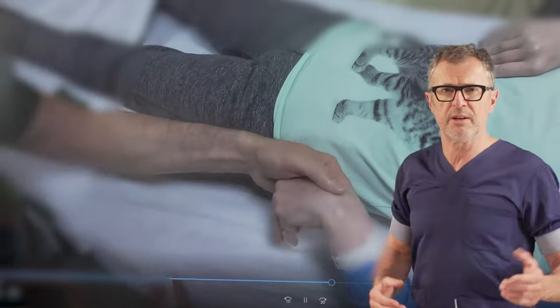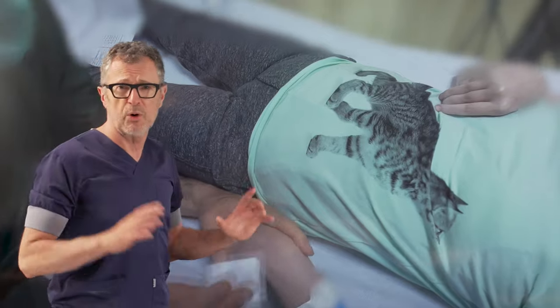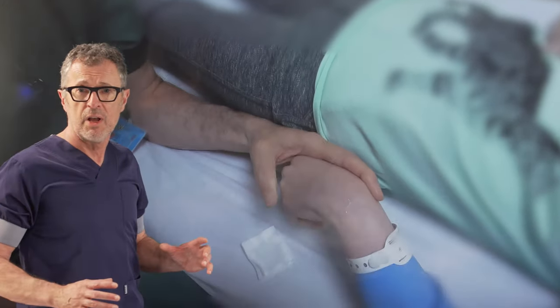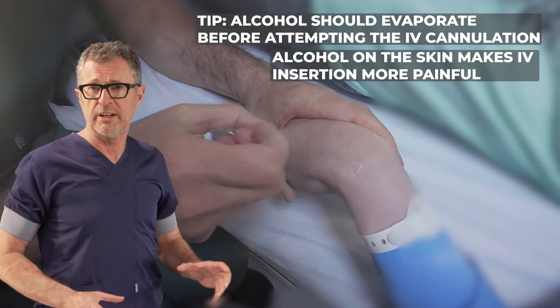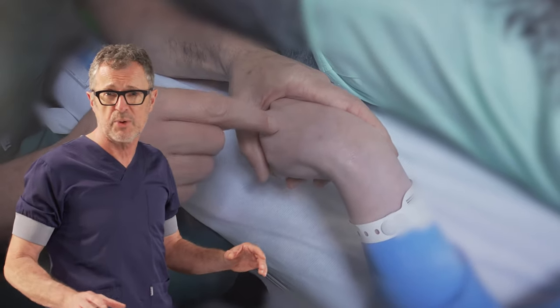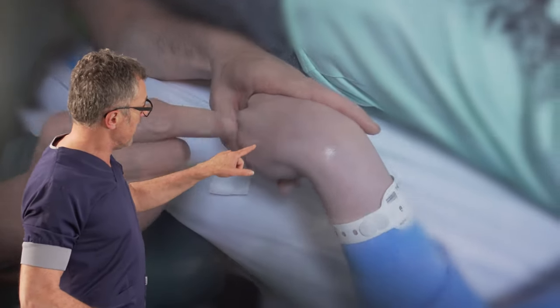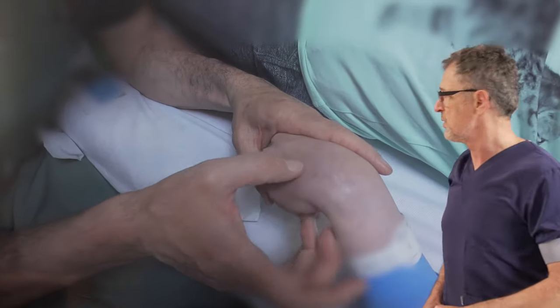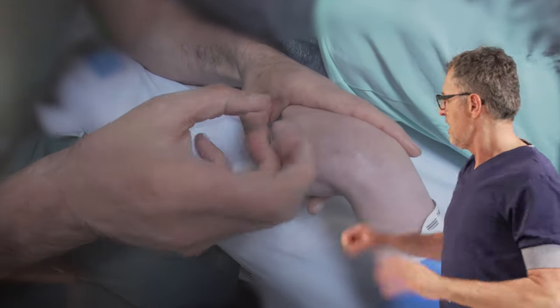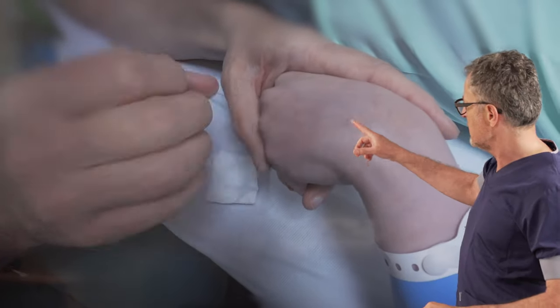Now we're going to prepare the skin — use a little bit of alcohol or disinfectant. Make sure that the alcohol is dry before you approach the skin with the needle, because inserting the needle through skin that still has alcohol on it will be extremely painful. So you really have to make sure it's dry. I'm going to dry that a bit more and continue tapping.